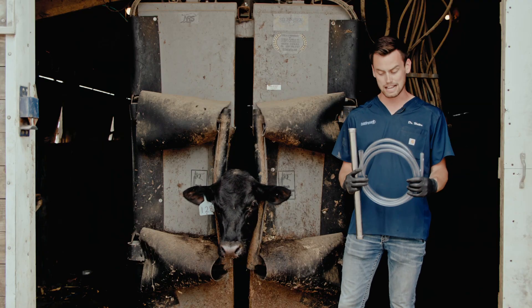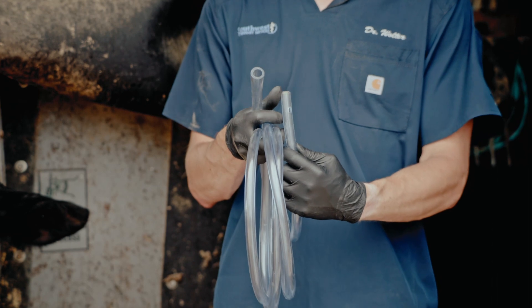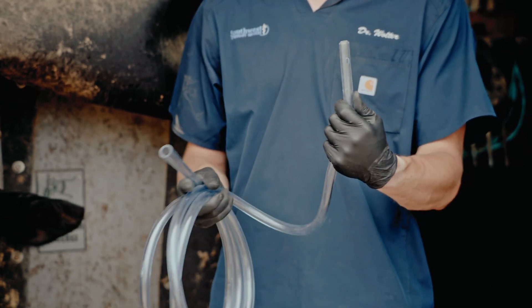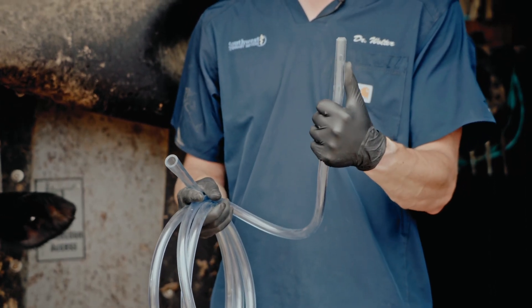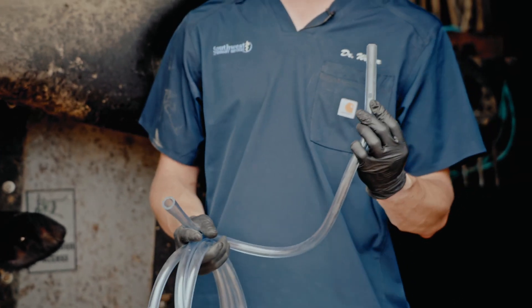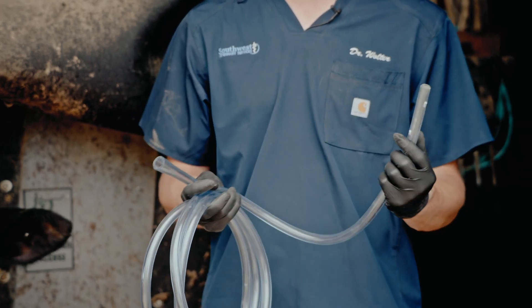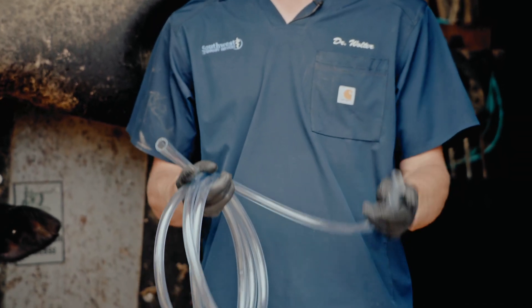The tube itself has a curved end that is a lot smoother when passing it down the esophagus of the animal — this is the end we want to pass. There are also multiple holes inside, which ensures it doesn't plug so we can still effectively release the gas in the rumen.